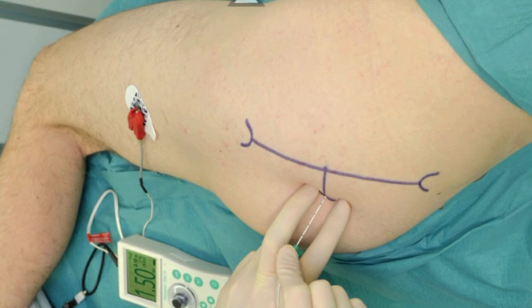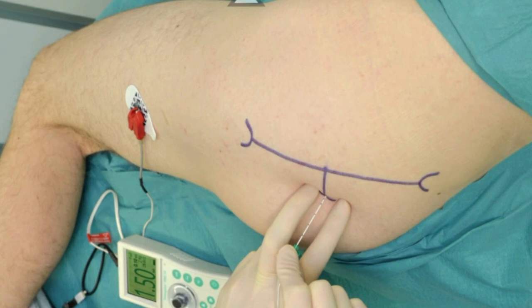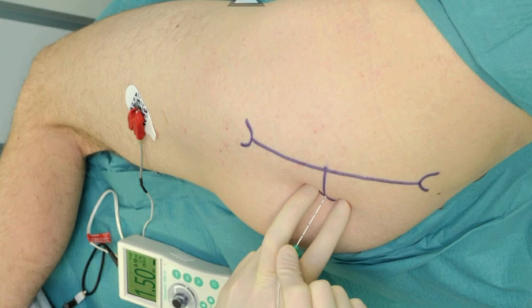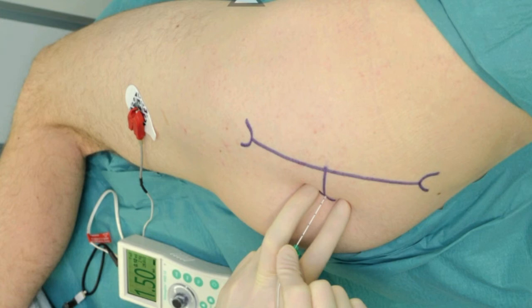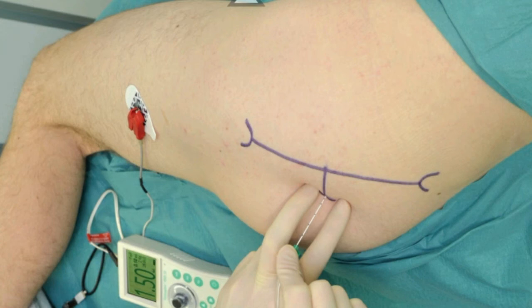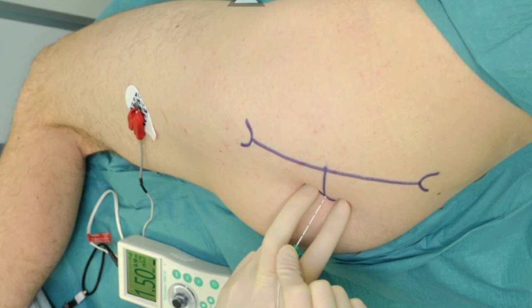After cleaning with an antiseptic solution, local anesthetic is infiltrated subcutaneously at the determined needle insertion site. The fingers of the palpating hand should be firmly pressed on the gluteus muscle to decrease the skin-to-nerve distance. The palpating hand should not be moved during block placement, as even small movements can substantially change the needle insertion site position because the skin and soft tissues in the gluteal region are highly mobile. The needle is introduced at an angle perpendicular to the skin plane.